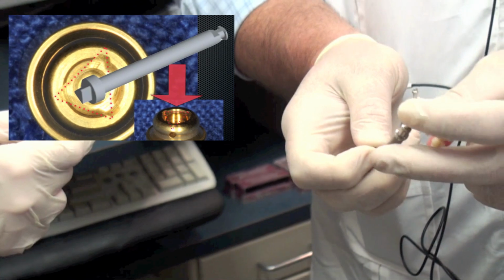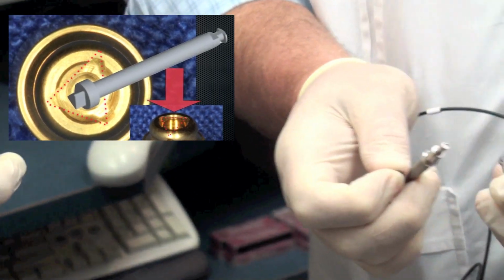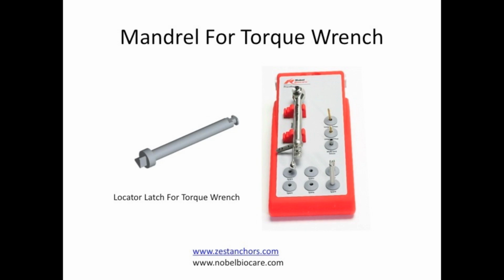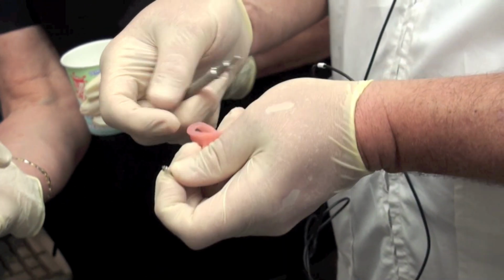Okay, so this little mandrel is going to fit right there. It fits in my prosthetic kit, and so that little mandrel replaces this part for putting it in. It's a lot easier to tighten it down. Okay, so I'm going to put this back in. We'll get you to put it back in.